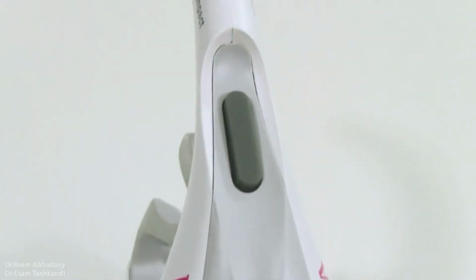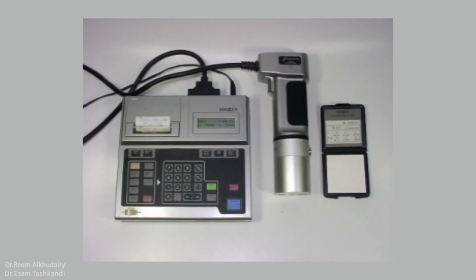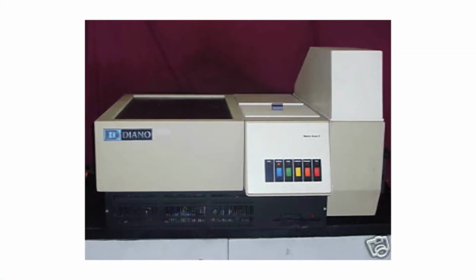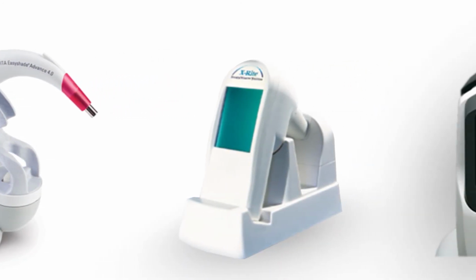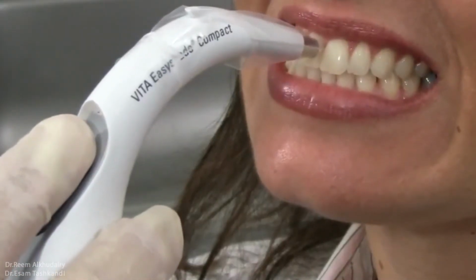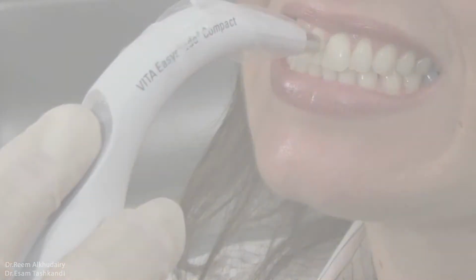Instrumental methods of shade matching have been designed to aid clinicians in determining tooth colors. The earliest device was first introduced in the early 80s, but its inadequate design and accuracy minimized its success. A newer generation of technologies that focus on analysis and color determination were developed, such as spectrophotometry and colorimetry. A spectrophotometer measures light reflectance at different wavelength intervals over the visible spectrum.